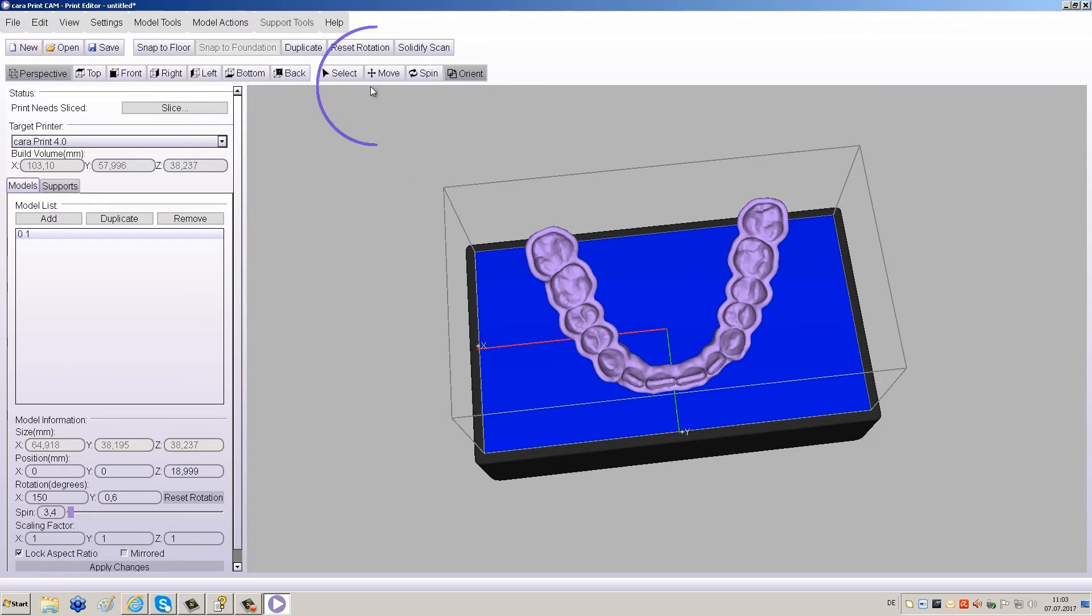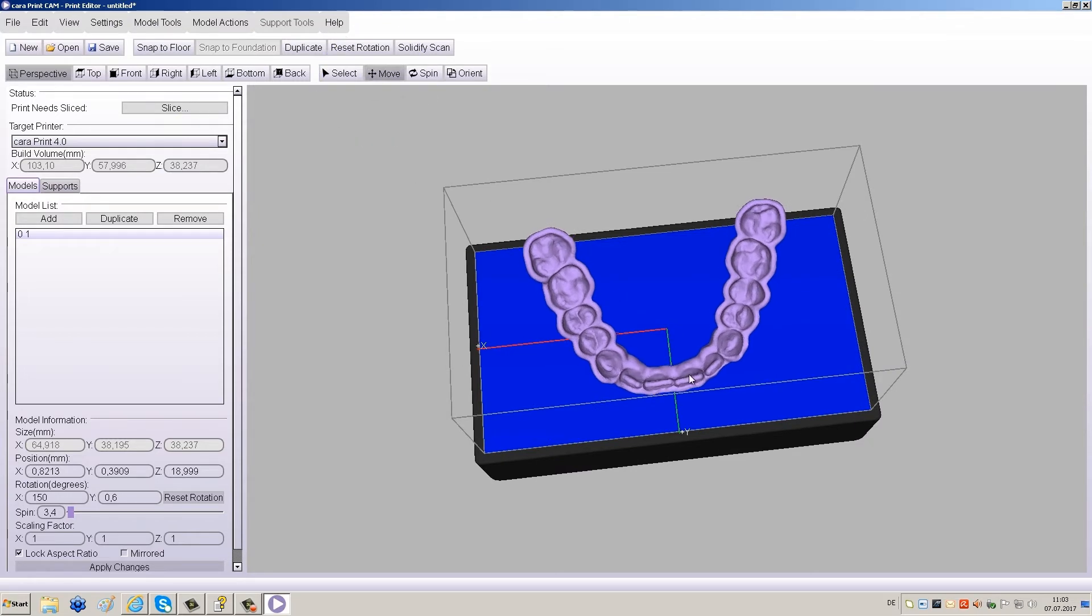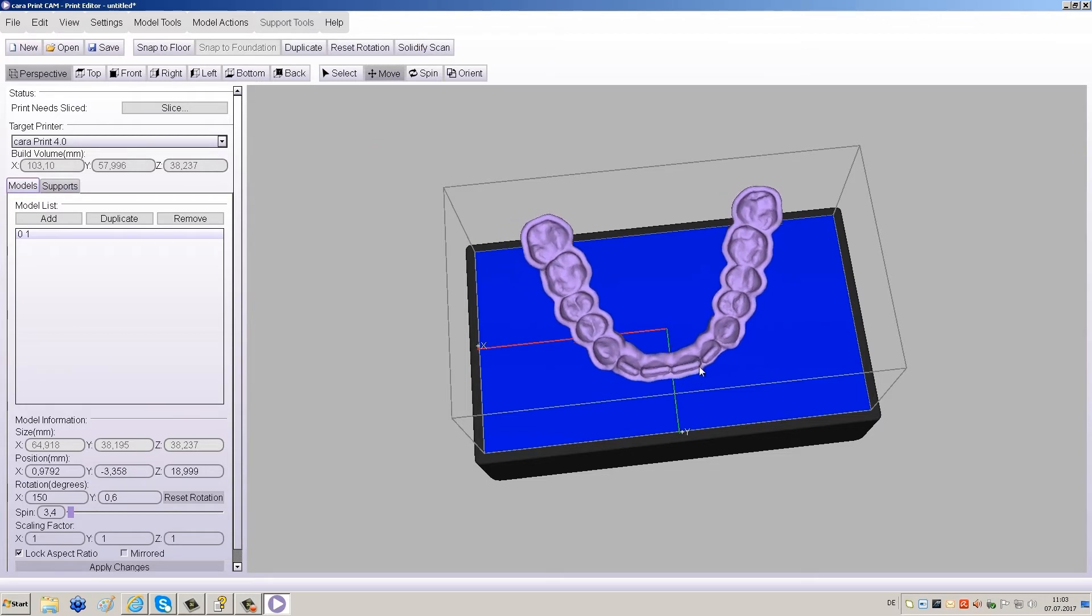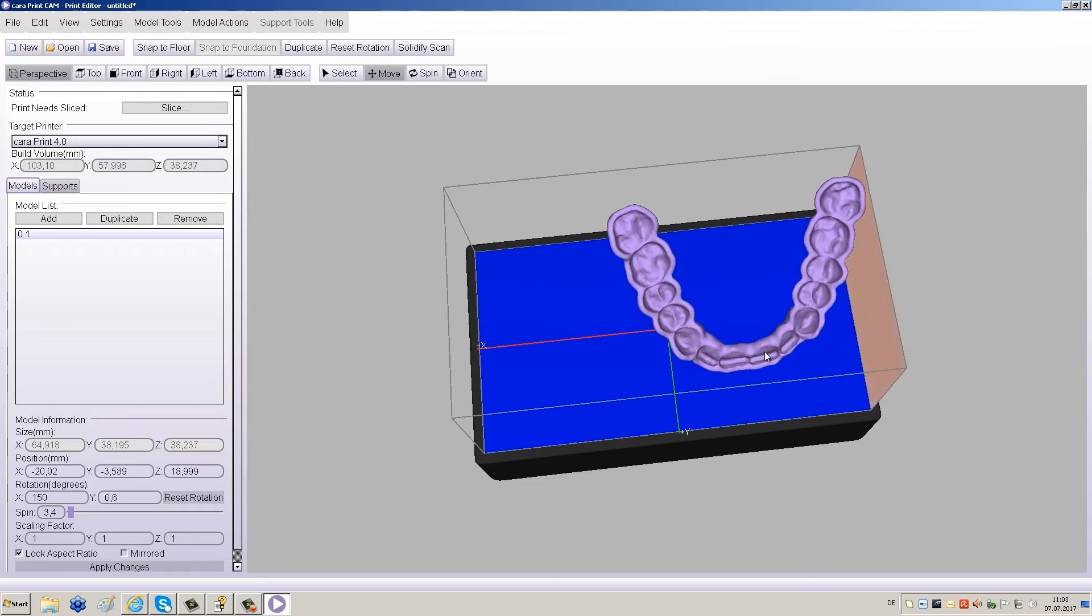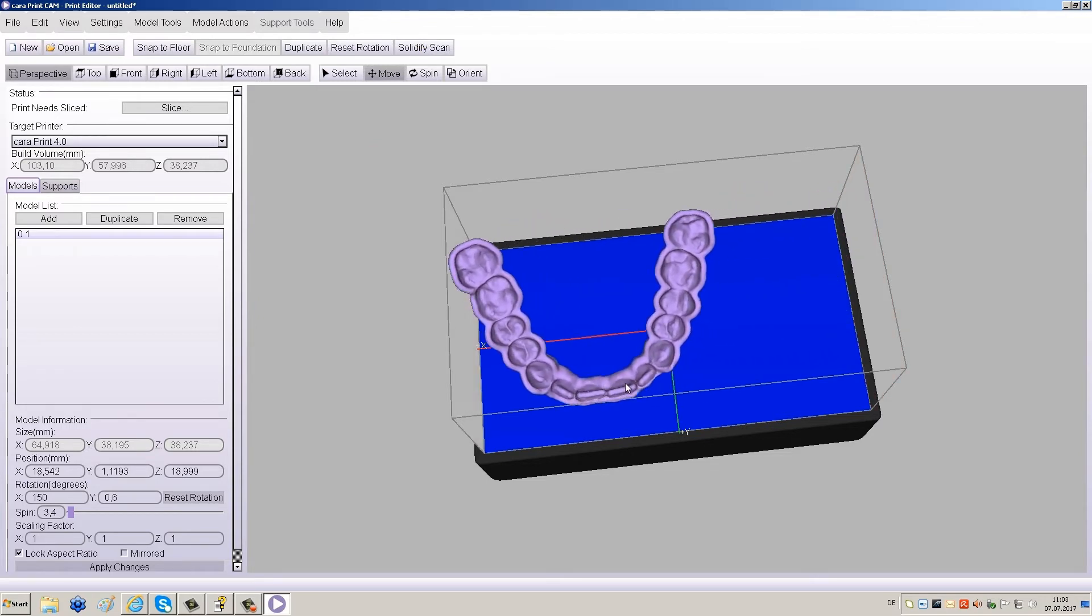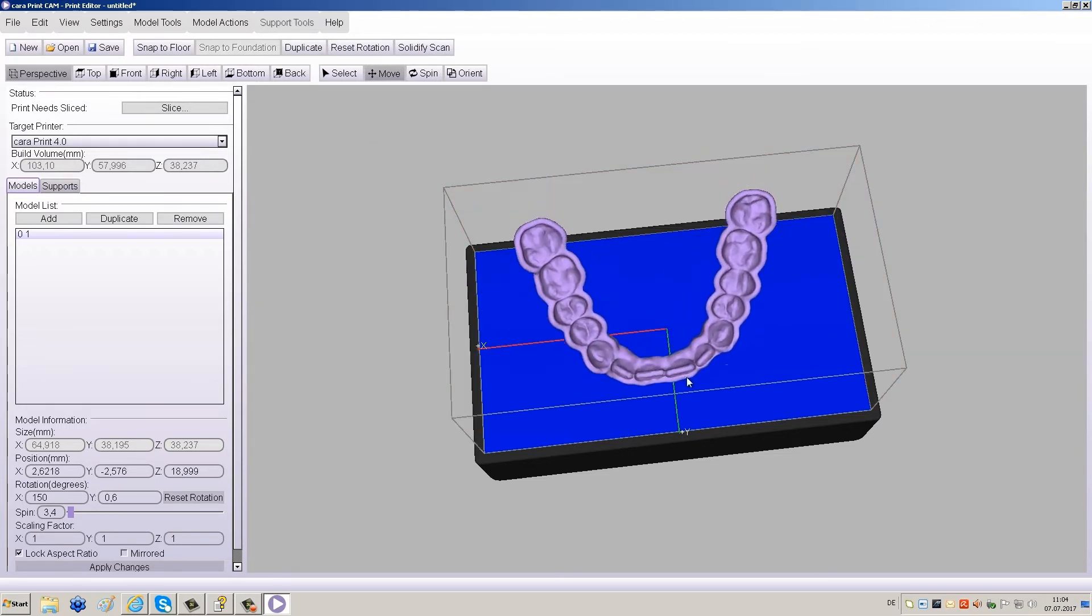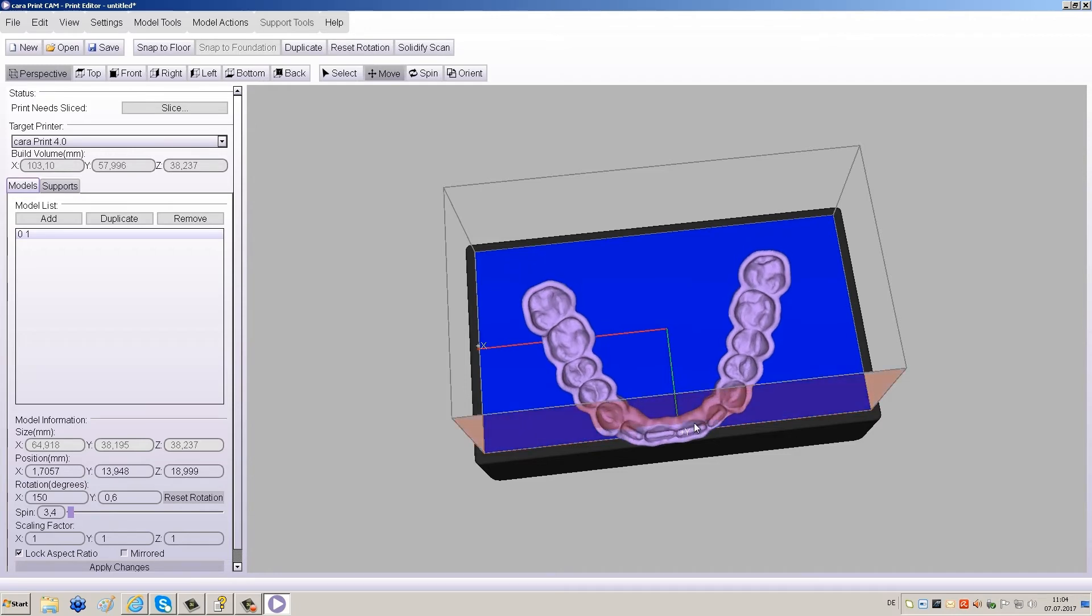You can also move the object within the build area by clicking Move and then dragging it with your mouse. Red walls will appear if any part of the restoration falls outside the printable area.